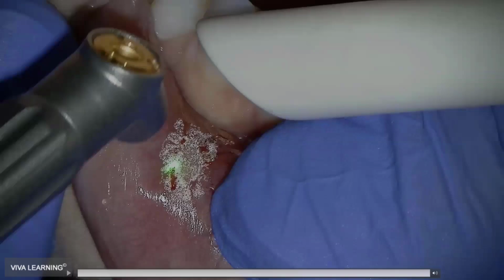No one's ever gotten a root canal because they used this laser. If anything, there's water spraying. The video I just showed you had no water. If anything, the water that's spraying down on the tooth is helping to cool the tooth as well.